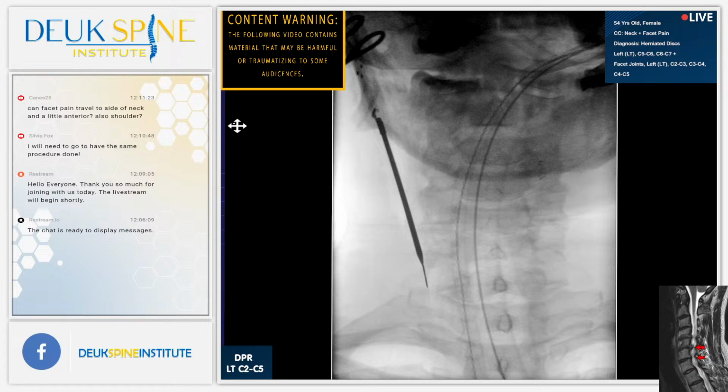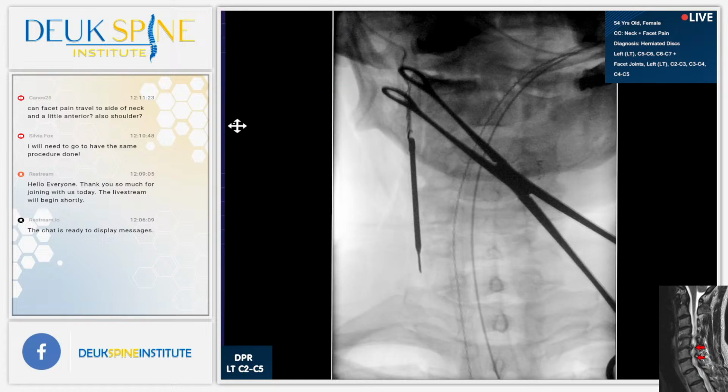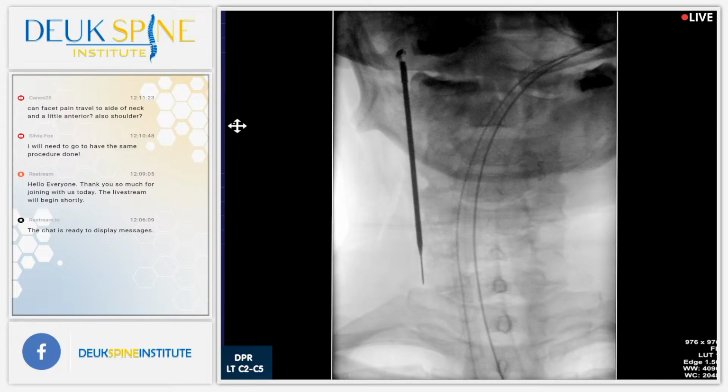And the nerve that transmits the pain up to the brain, where you perceive the pain, comes right around the spine, right in this area where we're working. The problem with RFA, radiofrequency ablation, is that it doesn't generate a powerful enough force, electrical force, energy force, to destroy the pain nerve permanently.